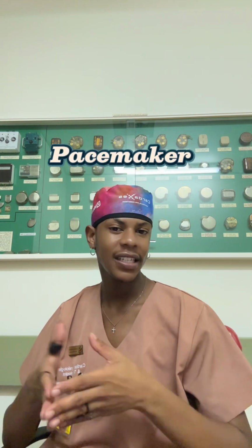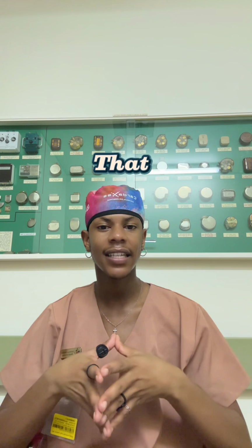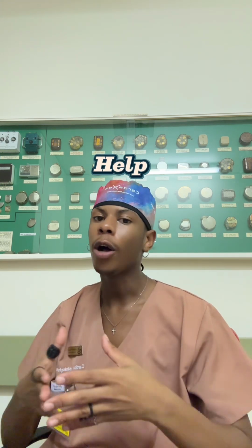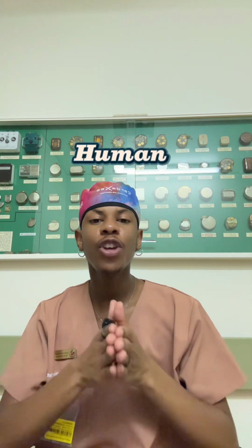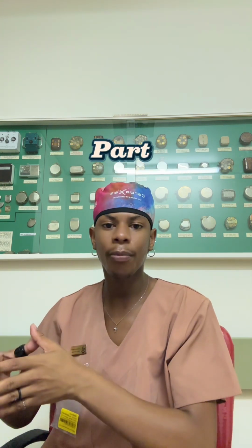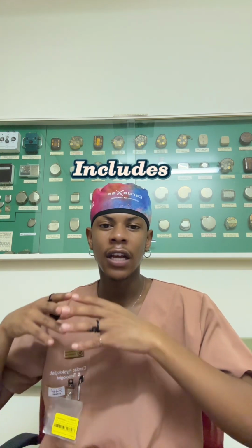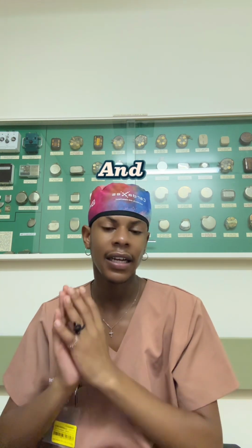Have you ever heard about a pacemaker? A pacemaker is a device that is used to help with the heart's electrical activity. So a human heart has two major components. It has the mechanical part, which includes your heart chambers and the blood flow.